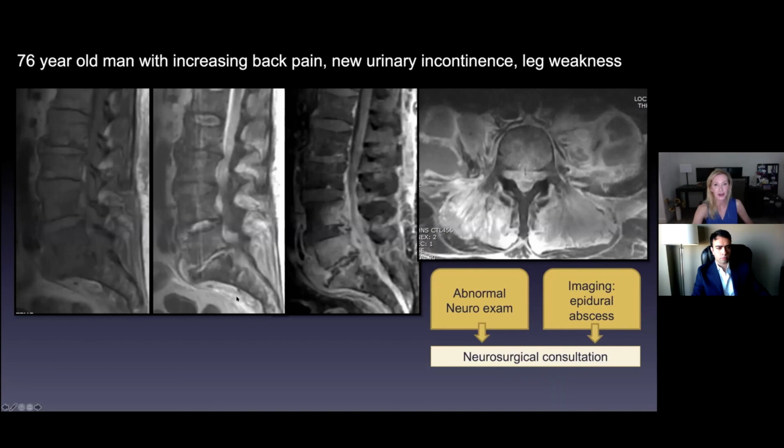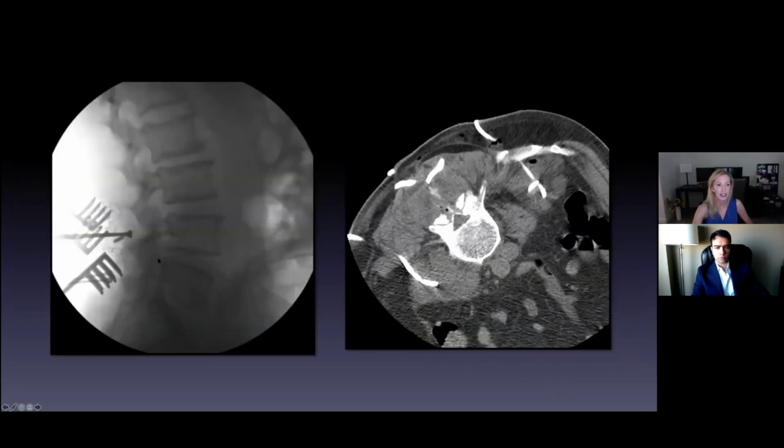Let me just show you and then Dr. Rasouli can comment. So this is the surgical picture where they went in to clean this out. This is my picture. So I got to treat the psoas abscesses. So in radiology, whether it's interventional or neuro or MSK body, we go in there with CT guidance and I put in pigtail drains. So we sample it, we can send it off for culture. We already knew this one was MRSA. And then put in pigtails to drain these.